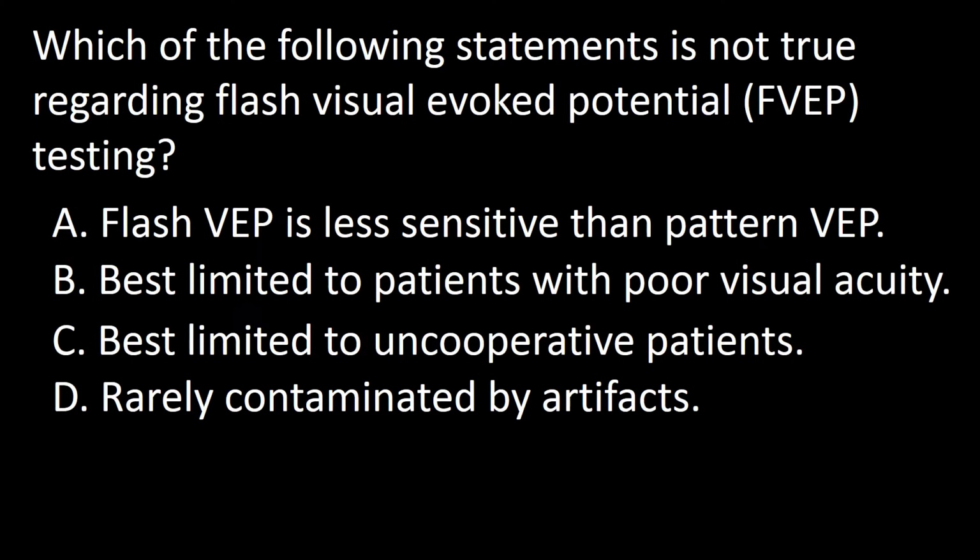Next question. Which of the following statements is not true regarding flash visual evoked potentials? A. Flash VEPs are less sensitive than pattern VEP. B. Best limited to patients with poor visual acuity.